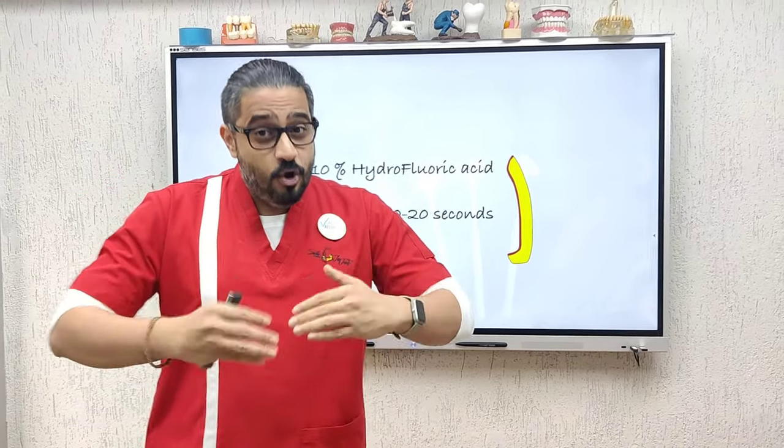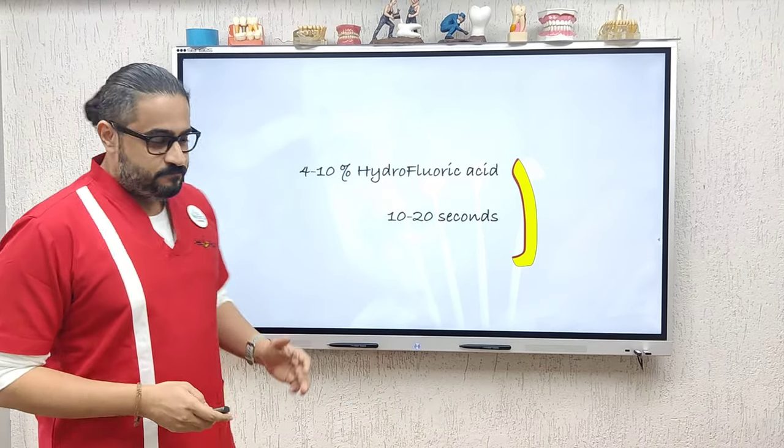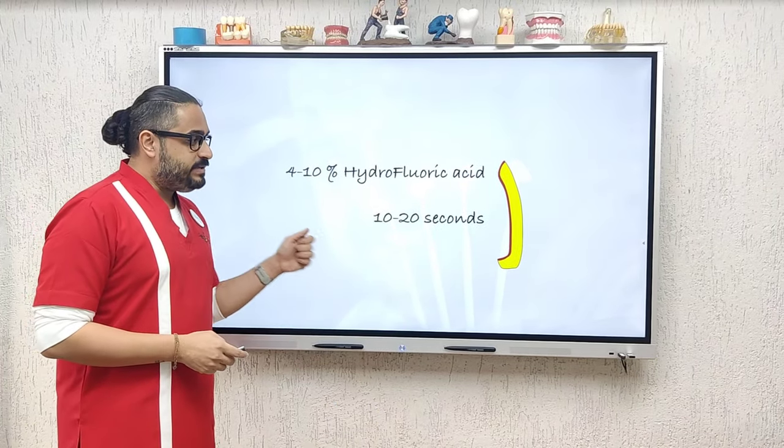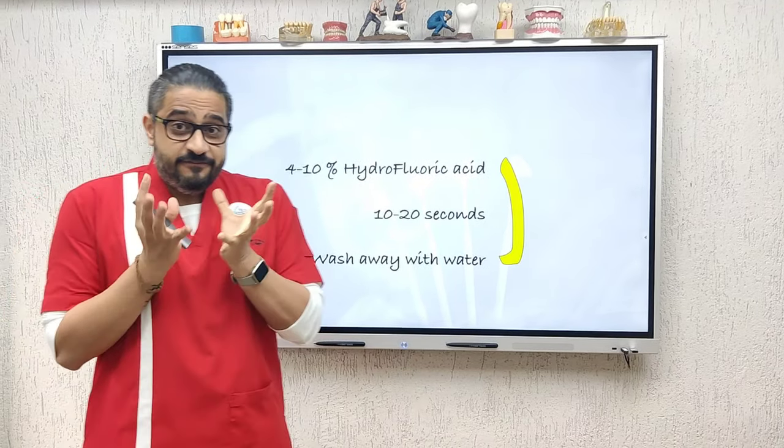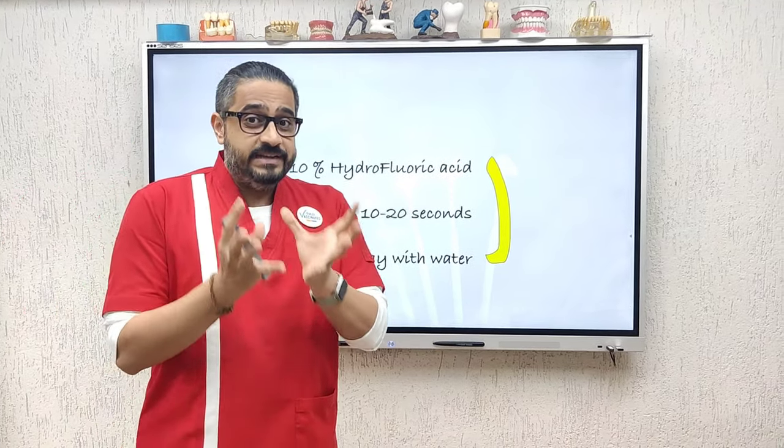Remember, this is a thin shell — do not over etch. Once the time has lapsed, take water and thoroughly wash it away. This gives you a very frosty, chalky, white appearance.